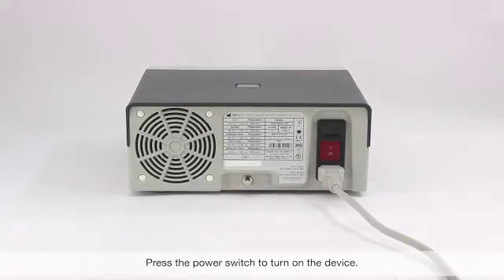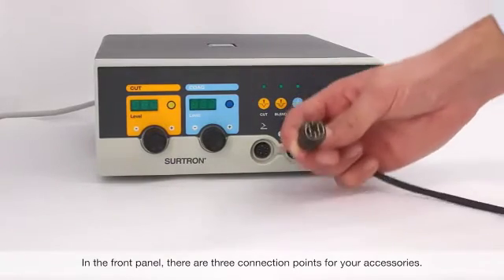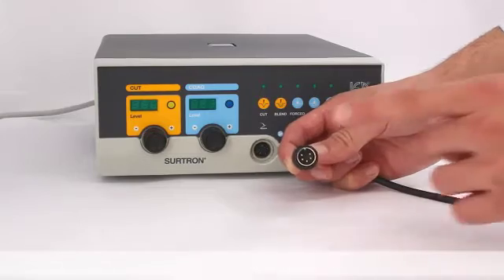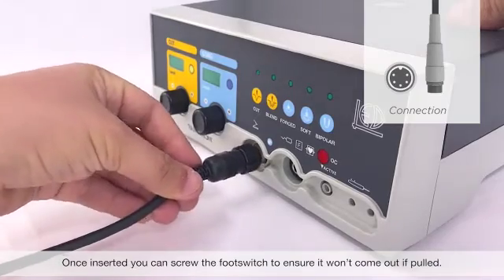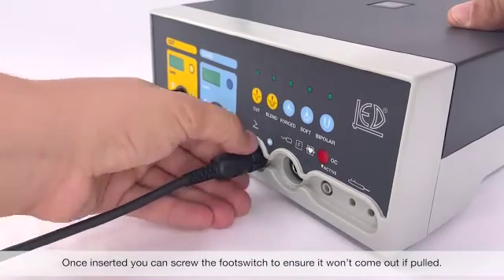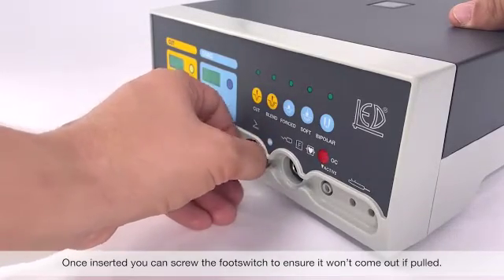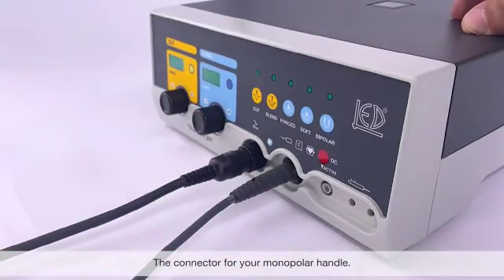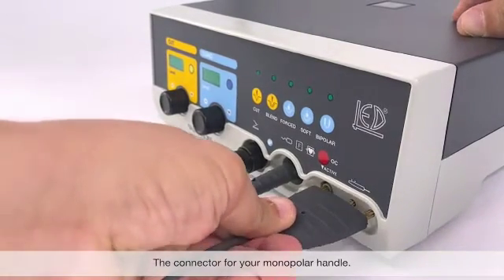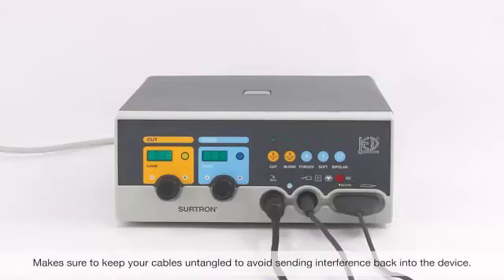Go ahead and press the power switch to turn on your device. In the front panel, you'll find there are three connection points for your accessories. The connector for your foot switch — once inserted, you can screw the foot switch connector to ensure it won't come out if pulled. A connector for your neutral cable and electrode, and the connector for your monopolar handle. Make sure to keep all your cables untangled to avoid sending interference back into the device.